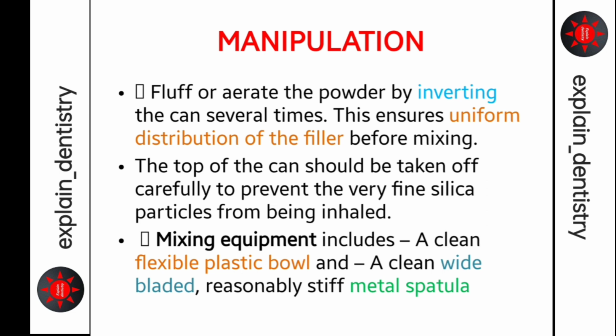Manipulation: fluff or aerate the powder by inverting the can several times. This ensures uniform distribution of the filler before mixing. The top of the can should be taken off carefully to prevent the very fine silica particles from being inhaled. Mixing equipment includes a clean flexible plastic bowl and a clean, reasonably stiff metal spatula.